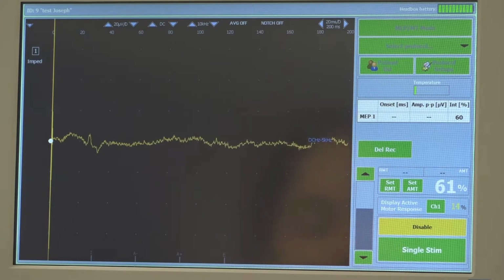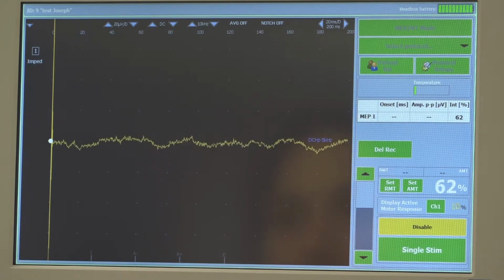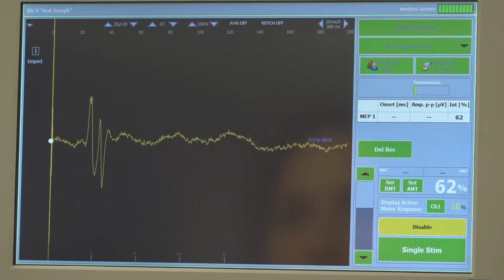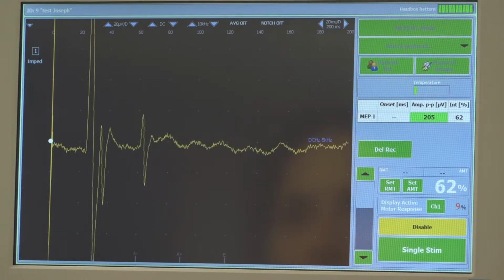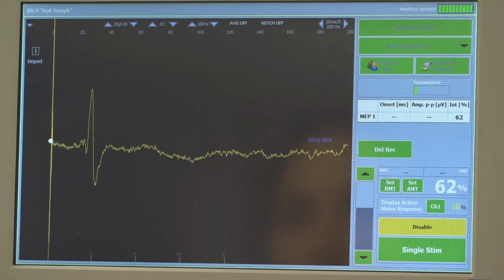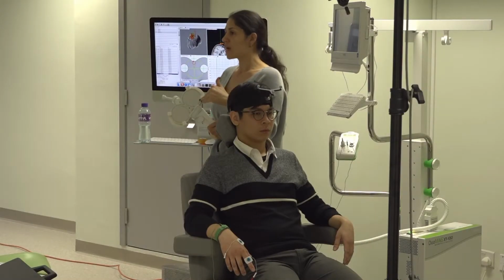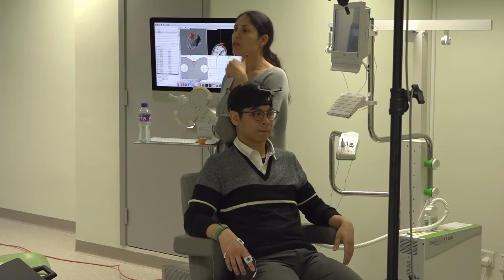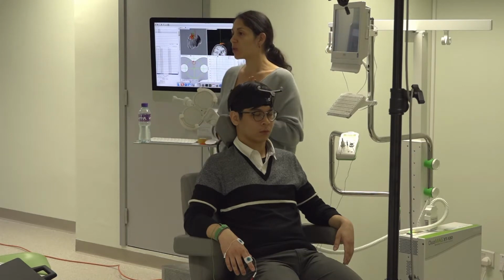Okay, now this will not work, so I'm going to go one high. I sent 6 pulses and nothing happened. So for me, that will be the threshold, because if I go one low, I don't get anything. But I go one up, and I have tested several, so I get 5, unfortunately more, but with 61, I will not get anything. So that will be the threshold I will use in this case.